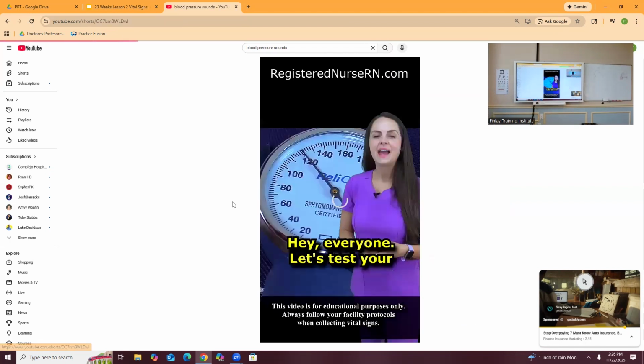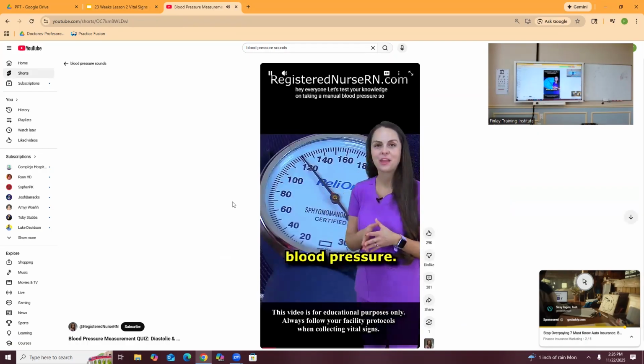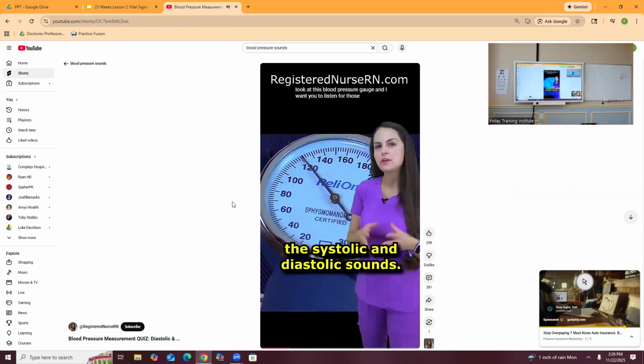Okay, you ready? Hey everyone, let's test your knowledge on taking a manual blood pressure. So what I want you to do is look at this blood pressure gauge and listen for those systolic and diastolic sounds.